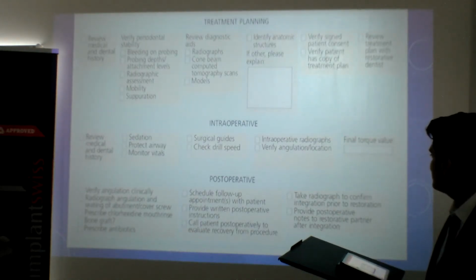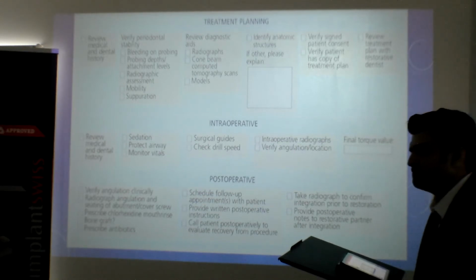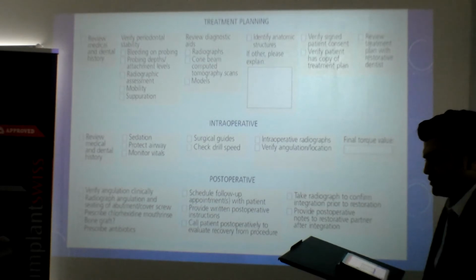In the surgical protocol, we have other lecturers who will be talking about the steps that you're going to be going for. But remember the drill speed, there's a lot of changes happening. Your implant systems may still say that you can go for 800 or 900 RPM, and you can go for it. Do you need to go for it is something to rethink. So start reading and studying. You were talking about collecting bone in the fluids, isn't it? Yeah, those things do matter.